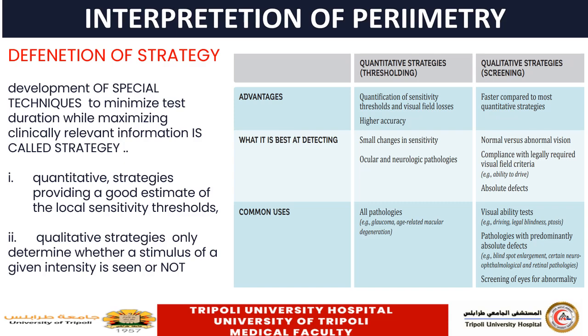For a stimulus with 6 degrees spacing, you need 550 retinal locations. And for 10 degrees spacing between stimuli, you need at least 190 locations to be tested for stimulus size 3. And this is very impractical and time consuming, and the patient will not be compliant with you.